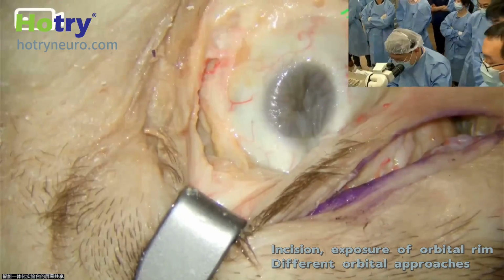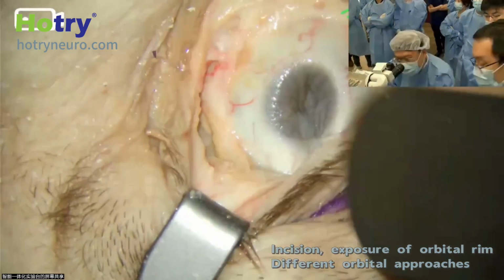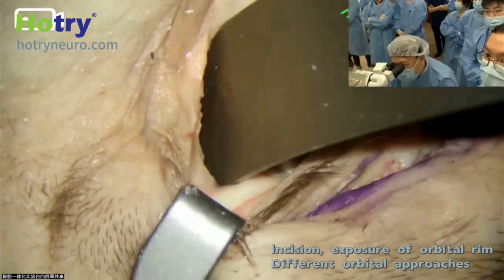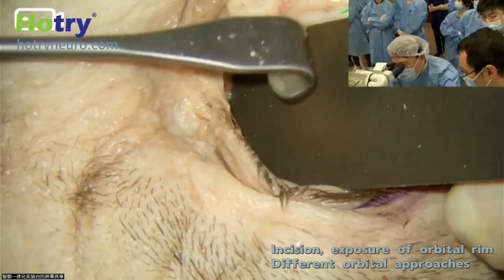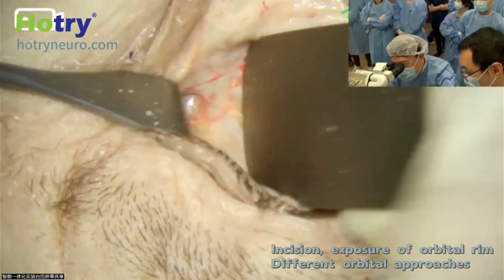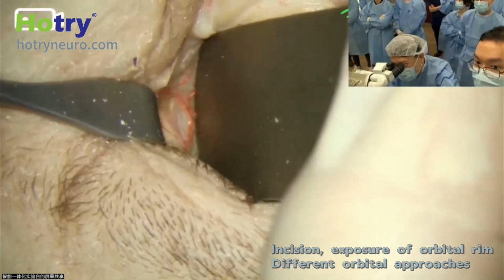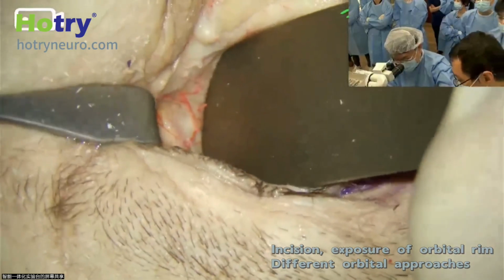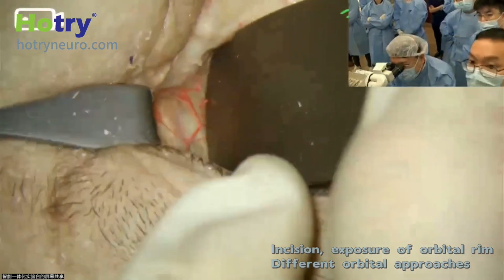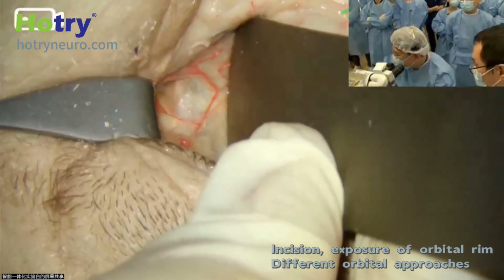We use a malleable retractor to put the fat inferiorly. And then we use the retractor to retract the medial canthus and caruncle medially.